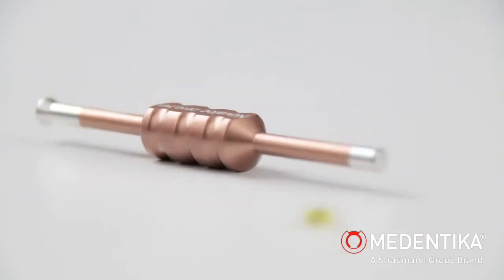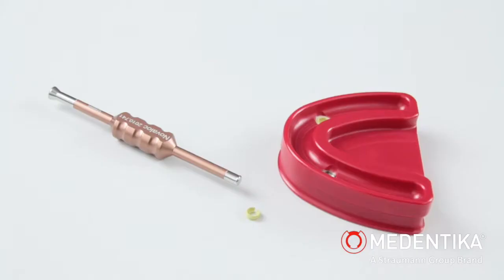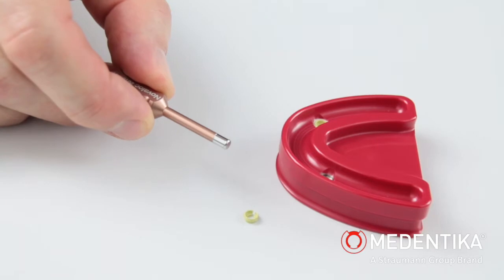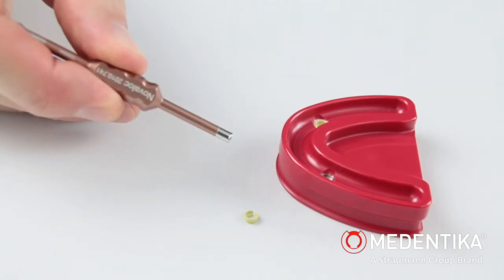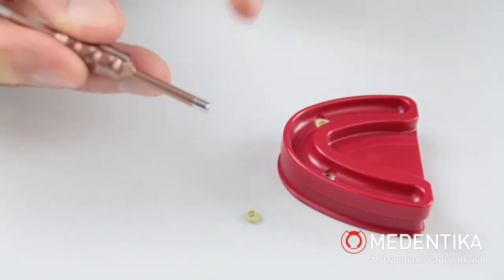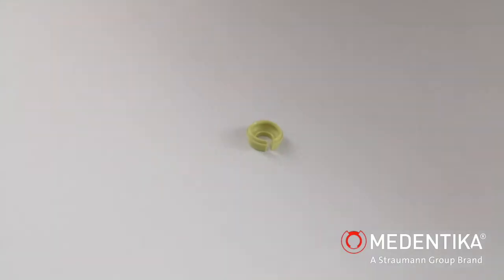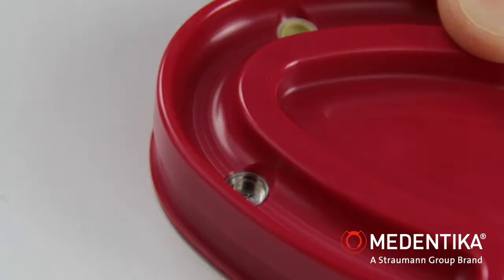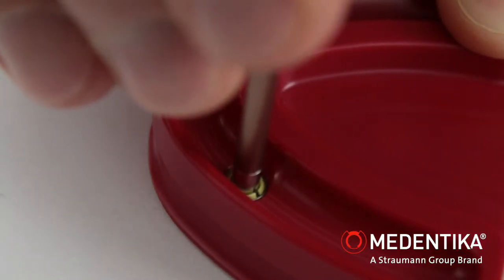To fit a suitable retention insert in the matrix housing, we use the placement and extractor instrument for retention inserts, brown, also with a dual function. The retention insert is picked up in a perpendicular direction using the cylindrical tip and then anchored in the matrix housing in a perpendicular direction with a perceptible click.